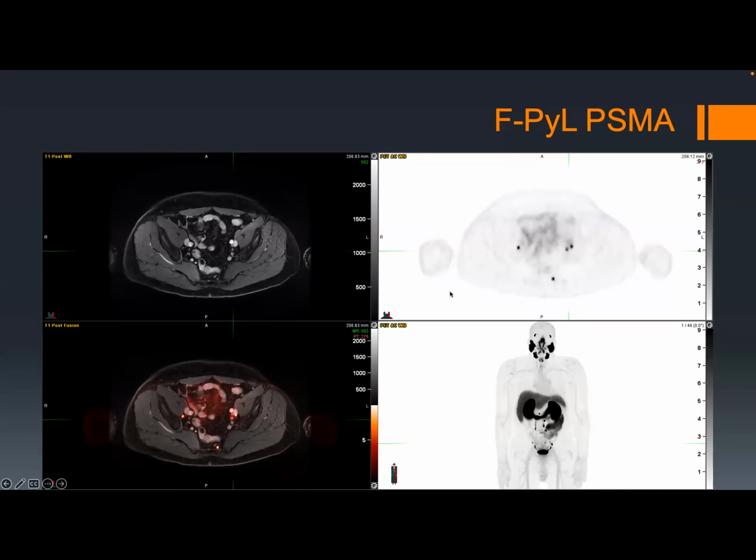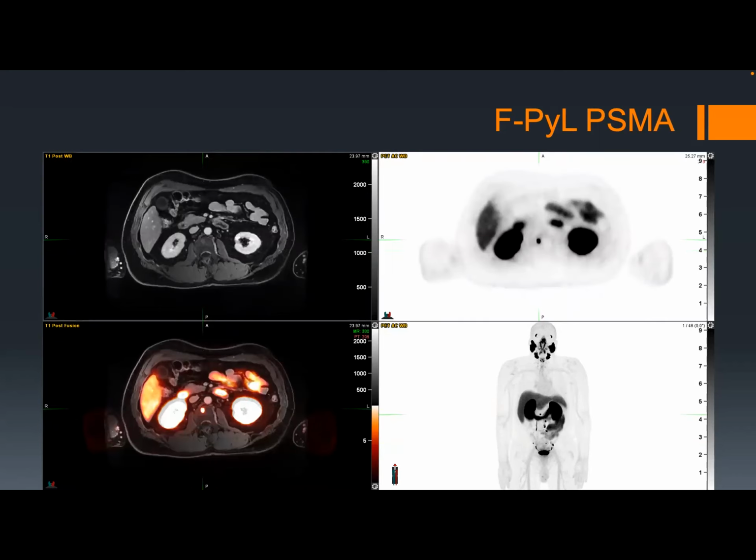And even on coronals, you're like, is that ureter? It's sort of in the area, but some people would call it, some people wouldn't. But we have a presacral node, right node, left node, and this is ureter here. And you can see things that get quite close to ureter and you're still able to distinguish them, because the machine is able to distinguish and you're not having this blur of PET counts making it difficult to tell things apart. So your lesion resolution is very, very high.